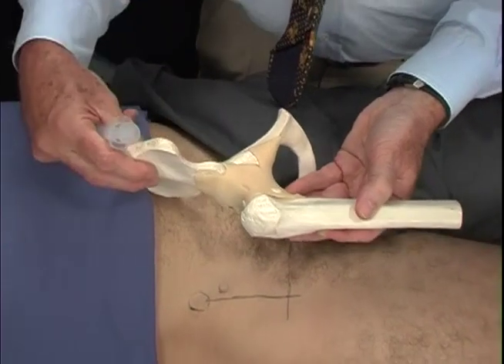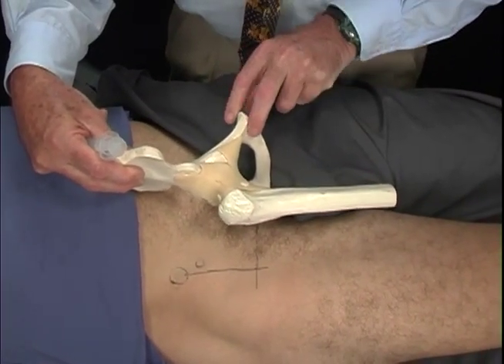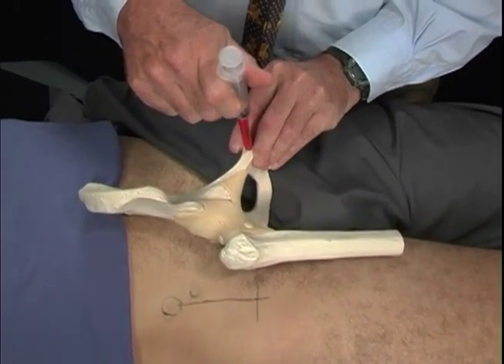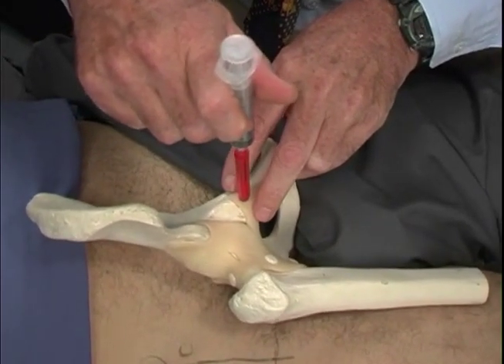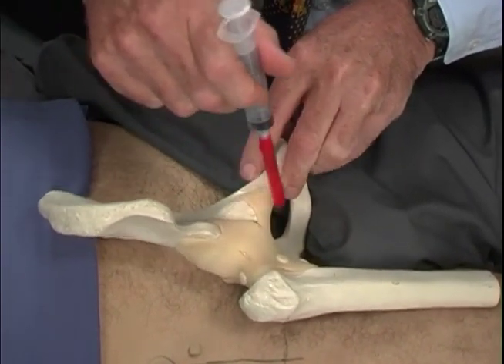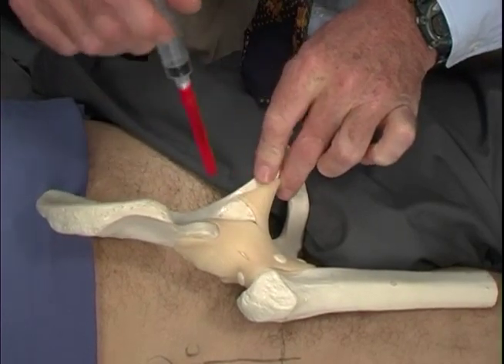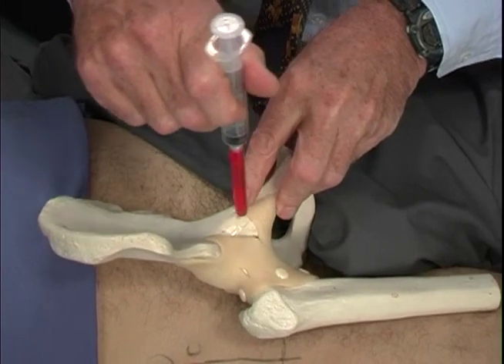So we're going to be locking the pubic symphysis between our fingers and coming down directly on it with our needle, moving over and marching over as far as we can to get the beginnings of these ligaments in this area. And you really push down quite firmly, and you'll find that people are tender right along that area.